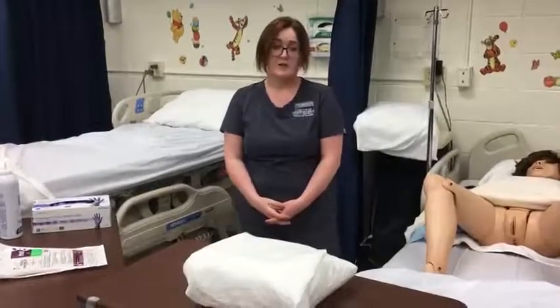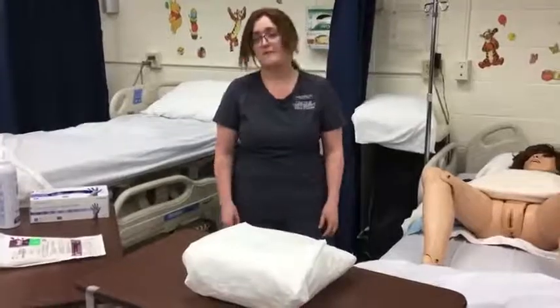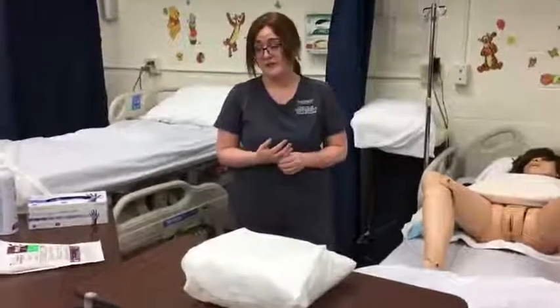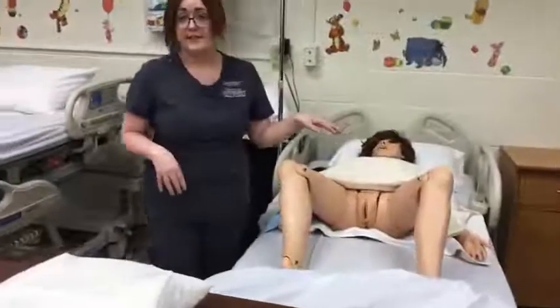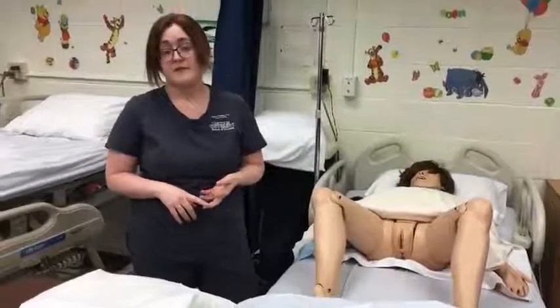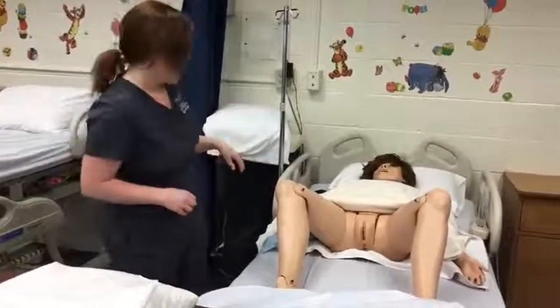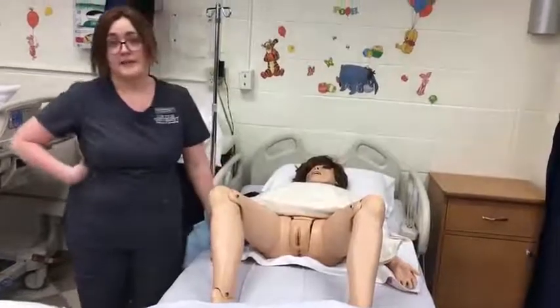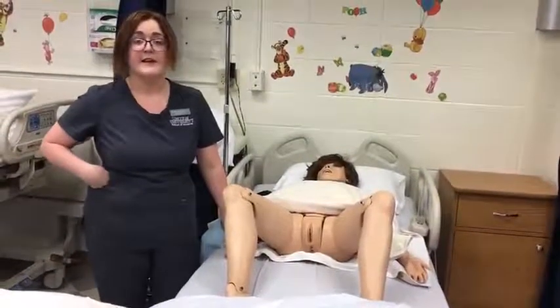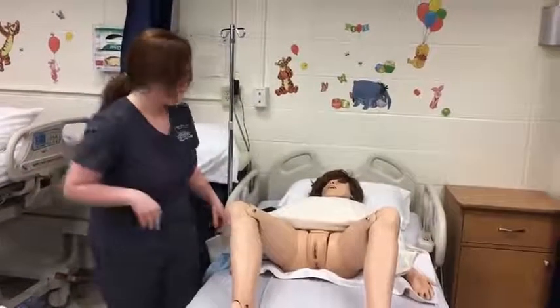It is April 12th, 2:10 in the afternoon, and today I'm going to be performing a Foley catheter on a female patient. I've already assessed the patient, the size and the method of catheterization, and their last void. I have identified the patient using name and date of birth, and I have identified any allergies, which this patient has an allergy to penicillin.